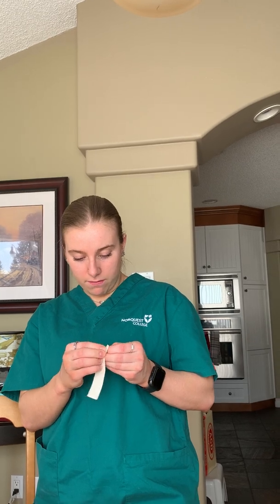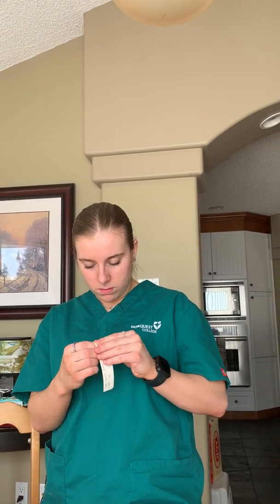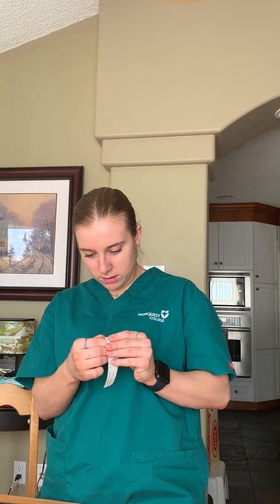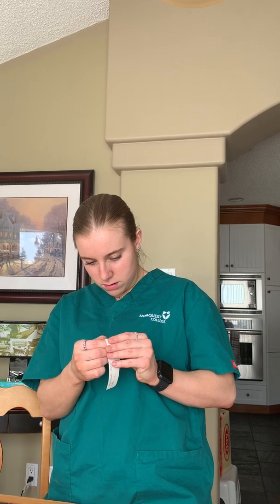I will then peel the label off, and we want to place it under the amount.